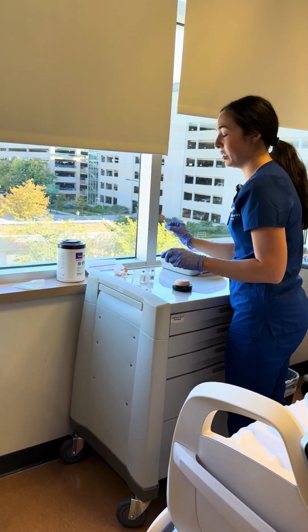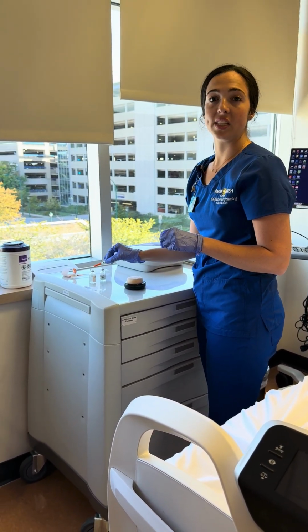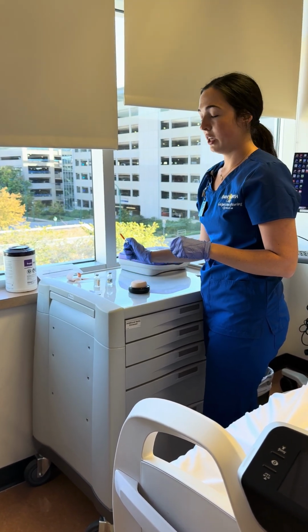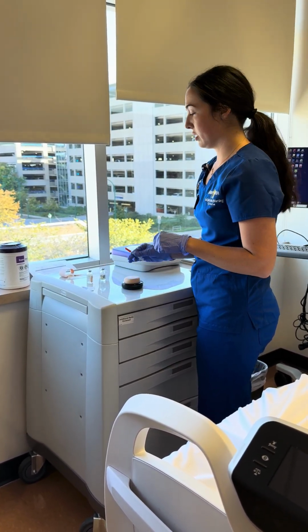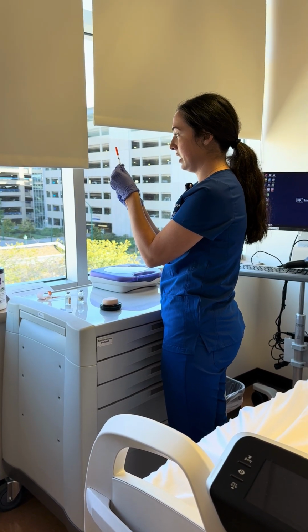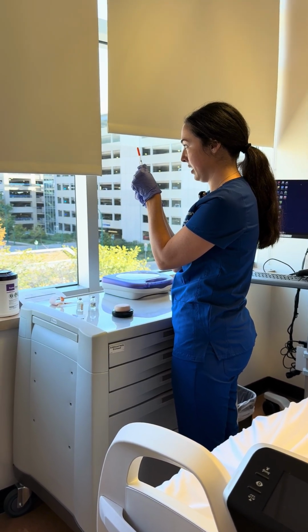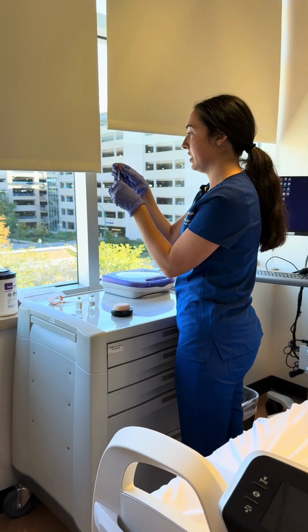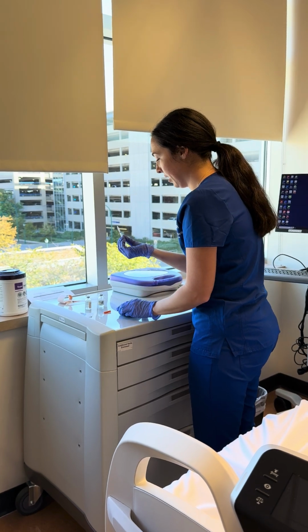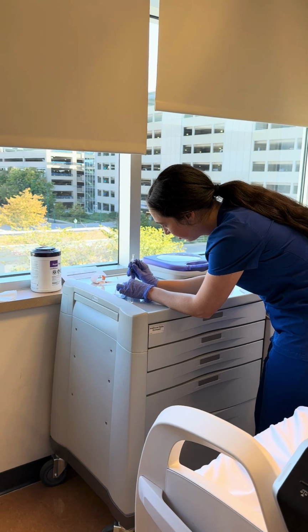Okay, so when doing insulin and when mixing two separate vials, we're going to go from cloudy to clear. So the orange here is our cloudy and the yellow here is our clear. So we have our NPH and our regular insulin. First thing I'm going to do is draw up 17 units of air. 16, 17. So the black mark is on the line of the 17. So I'm going to uncap my needle and I am going to inject 17 units of air.